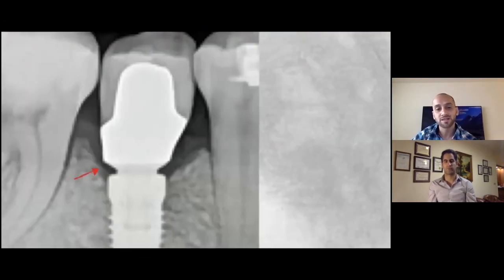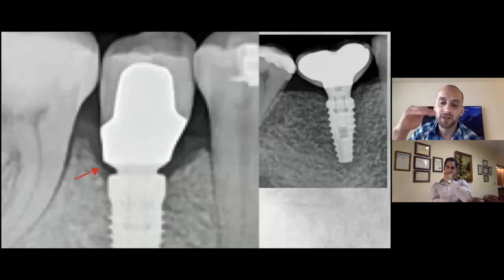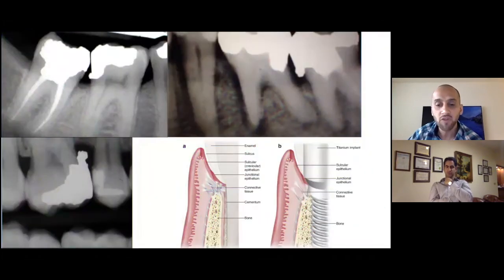It's very important to notice that, because that little bit of encroachment into biologic width can really lead to bone loss. By having a tie base platform that's higher, you can avoid situations like that. So it's very important to have this conversation with the laboratory technician and ask them, what tie base are you going to use here? How tall is the finish line on your tie base? It's very important to have this conversation. And unfortunately, we're not doing that.